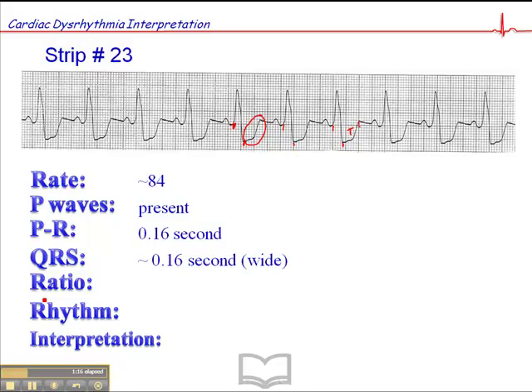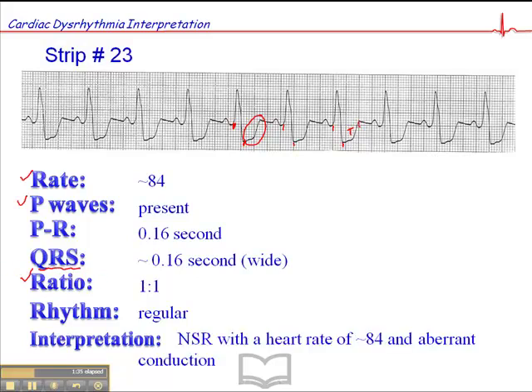The ratio here is consistently one P-wave to one QRS, and the rhythm is regular. So if you have a normal heart rate, P-waves, and a consistent ratio of P-waves per QRS — even though you have a wide QRS — then the interpretation is a sinus rhythm with a heart rate of 84 with aberrant conduction.